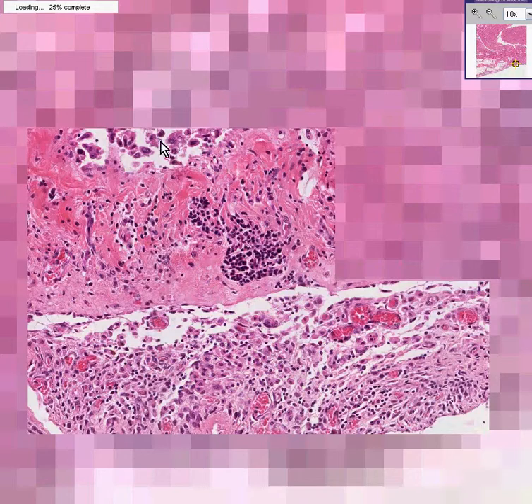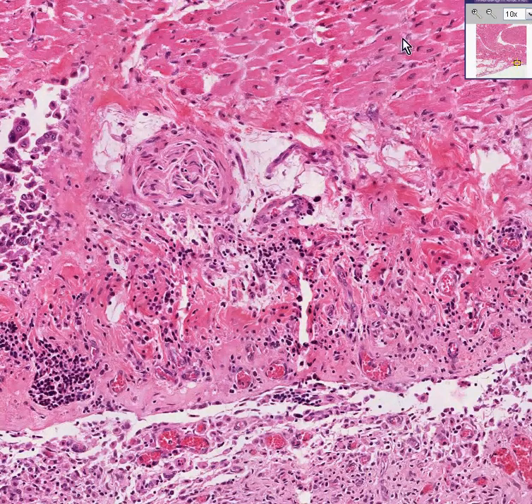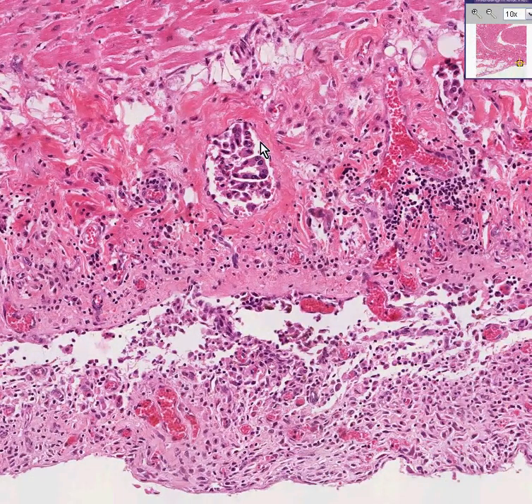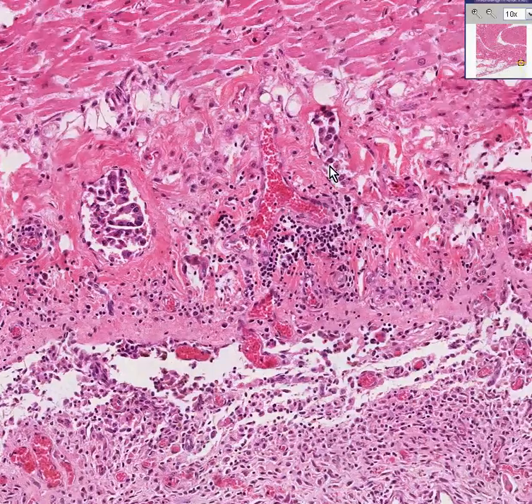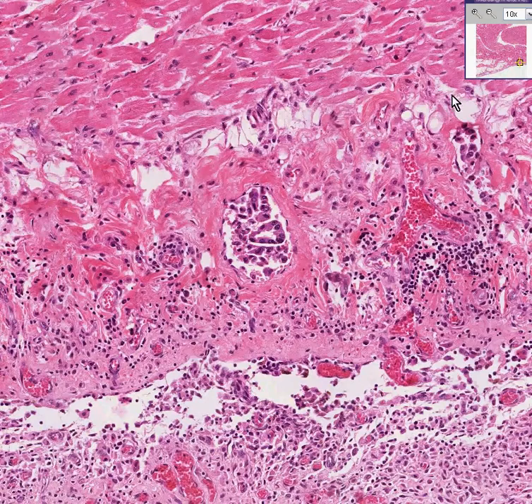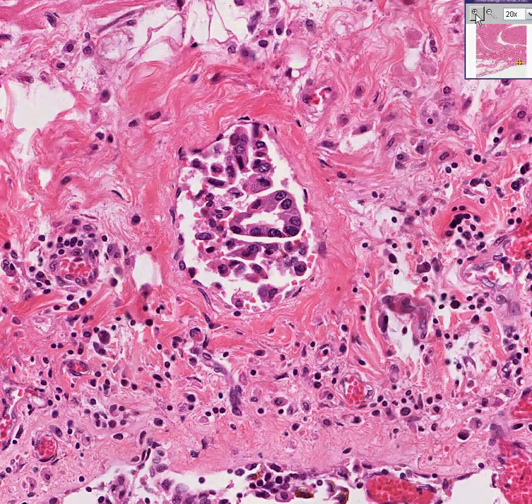We already saw this big tumor nest out here. We already saw this nerve. Here's some myocardium. So the myocardium here is kind of fibrosed to the pericardium, isn't it? But you know what this is. Here's another tumor nest. Here's another tumor nest. And we're getting to the point where we really don't have to blow up to see big, dark, ugly nuclei because we already have a smell for these cells. But certainly on high power, you could see they are irregular glands with dark, lumpy, black, variable, malignant nuclei.